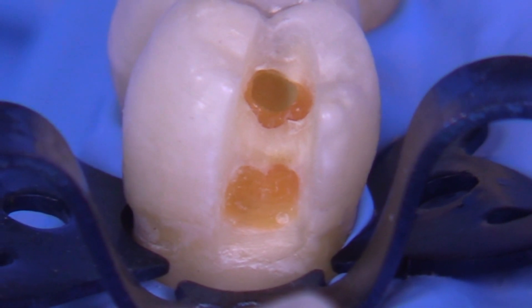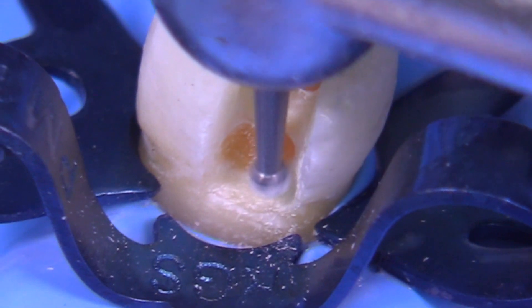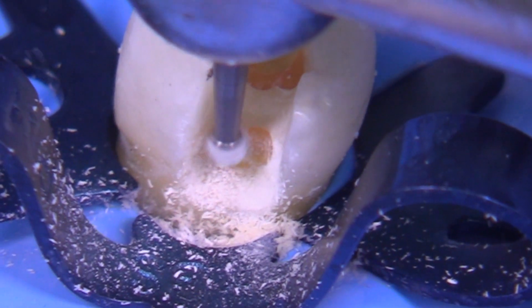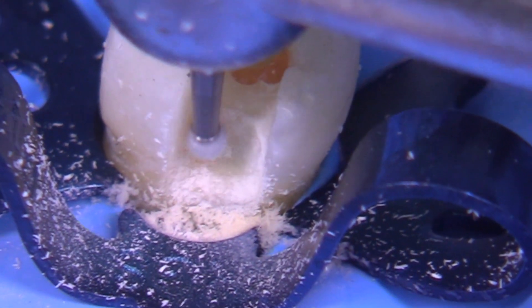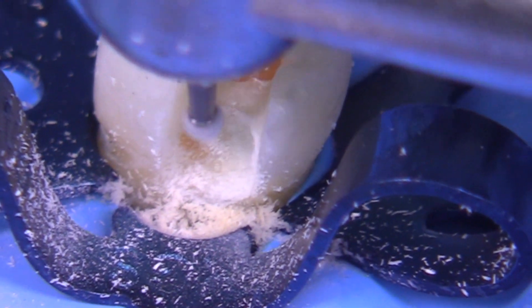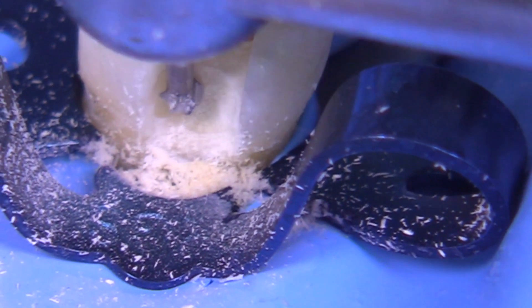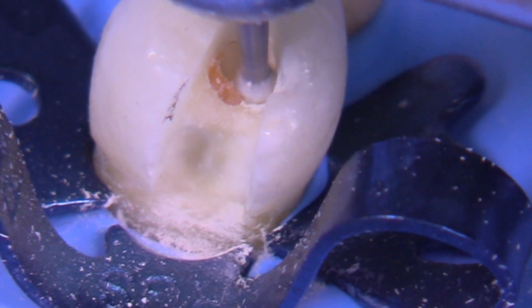I'm hoping that nomenclature sticks because it's definitely more technically correct. We still have lesions remaining internally, so we have a clean periphery in most of the preparation. Now we can turn our attention to the round bur on slow speed — I like using electric, turning it down to probably somewhere between 1,000 and 5,000 RPM. I also use water spray and constantly check what I'm doing with respect to removal, because with an electric with all that torque you could over-remove if you're not careful.